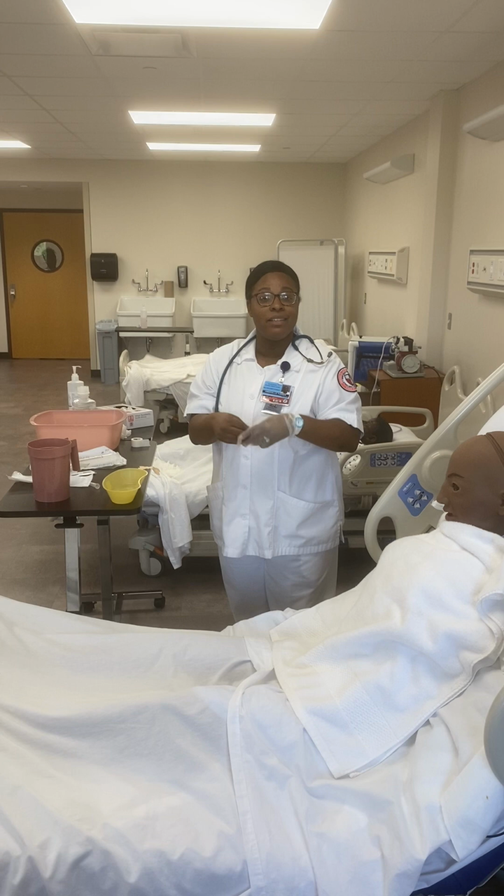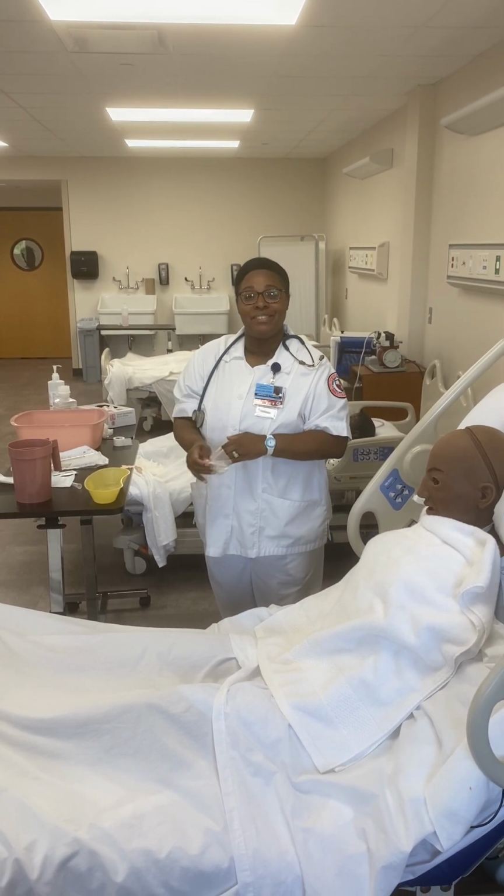And then dispose of my gloves, perform hand hygiene, and document the procedure. Thank you.